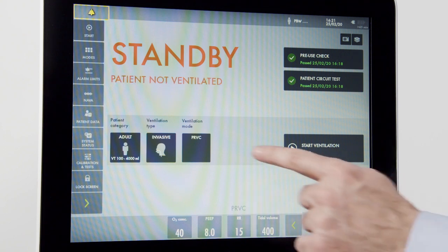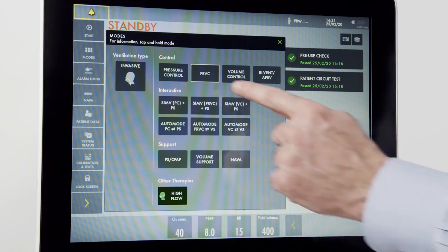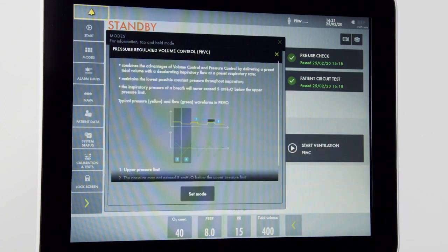Over to my ventilation mode, I have the option of all the modes available to me on the ventilator. For more information on a mode, I can press and hold. I will then get an informatic on the screen which will describe in detail the mode that I have selected.